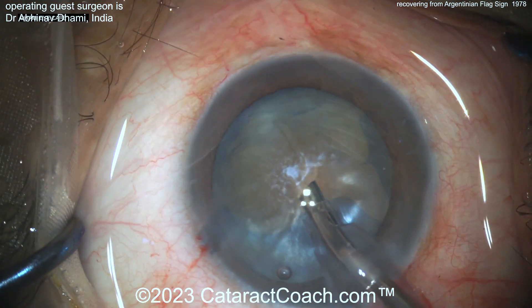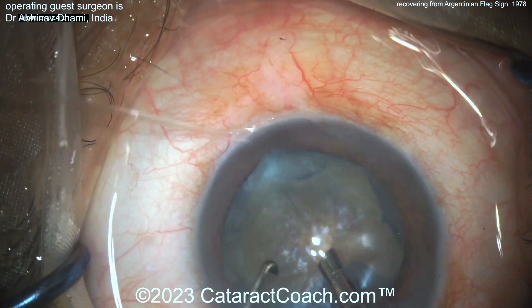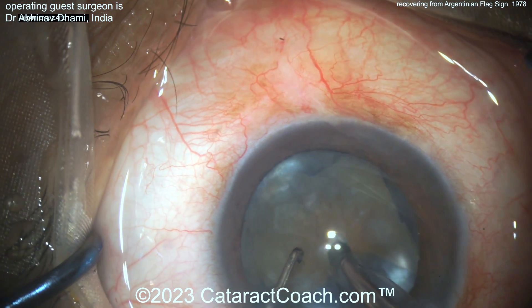Now going in to decompress using the FACO probe — but look at that capsule, especially under the FACO probe. That's going to need to be addressed. Don't catch that capsule with the FACO probe; it's going to be a big hot mess.